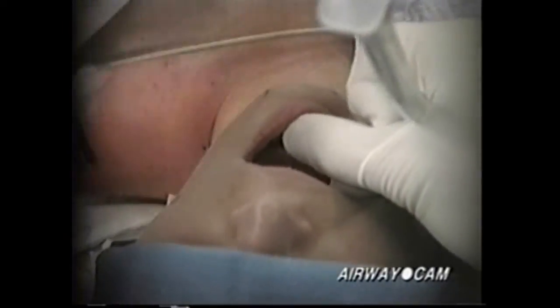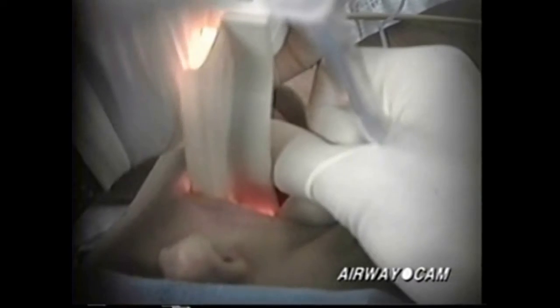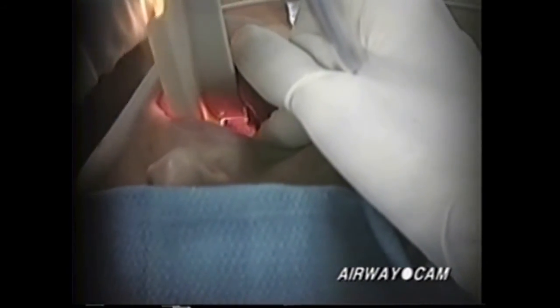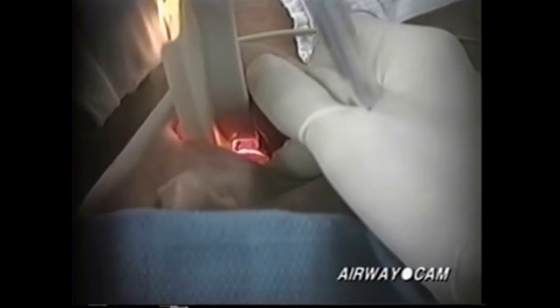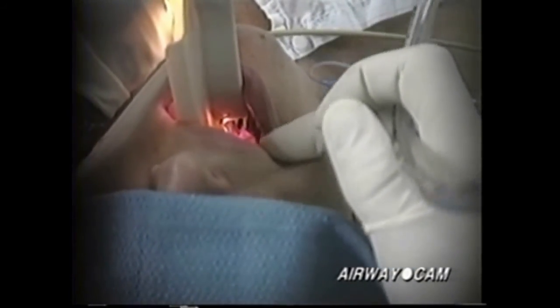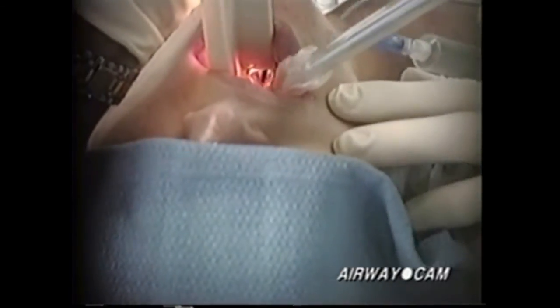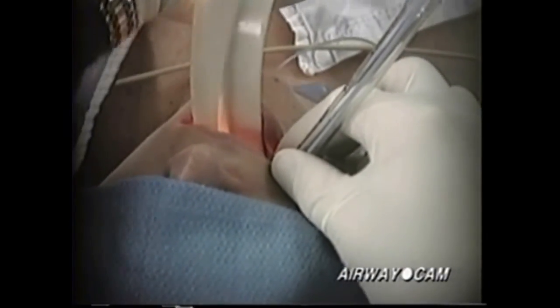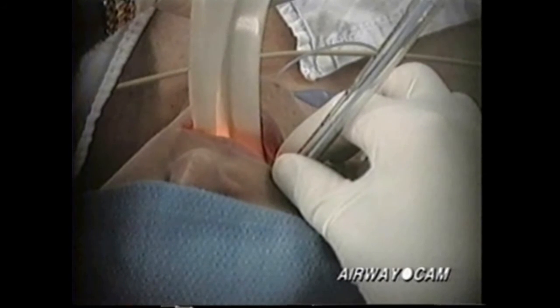The following intubation is also with a Macintosh No. 3 blade. The scissor technique is used to open the mouth. The pink posterior pharynx is well seen, followed by the epiglottis. Pressure on the hyoepiglottic ligament at the vallecula causes the epiglottis to flip upwards, revealing a nice view of the larynx. The endotracheal tube is carefully guided down the right side of the mouth into the glottic opening, and the tube is stabilized at the lip line. The tube should be inserted to 21 centimeters at the incisors in women and 23 centimeters for men.